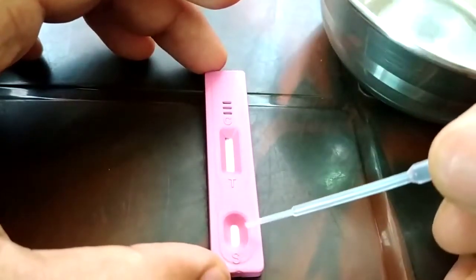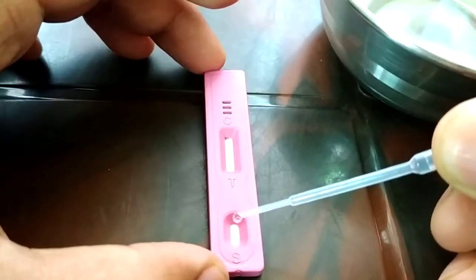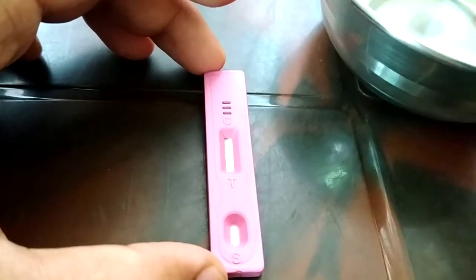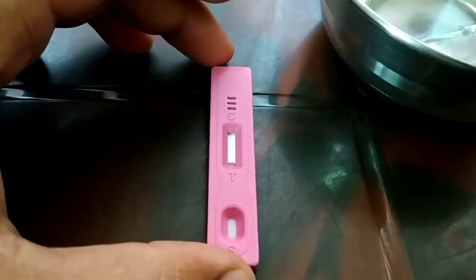You just have to drop two droplets of liquid right over here — you can see the S, the small box. Just two droplets of liquid right over here, and then wait for a while.